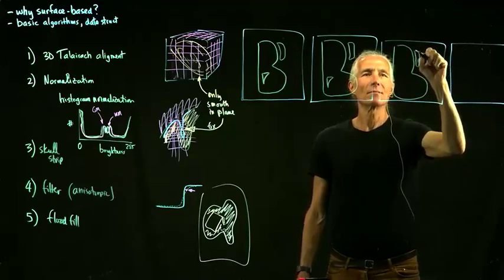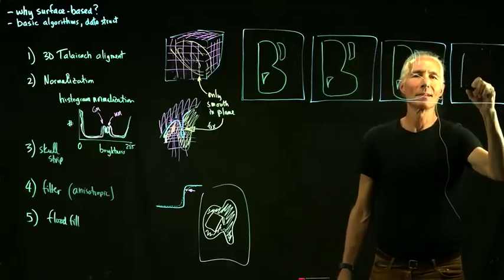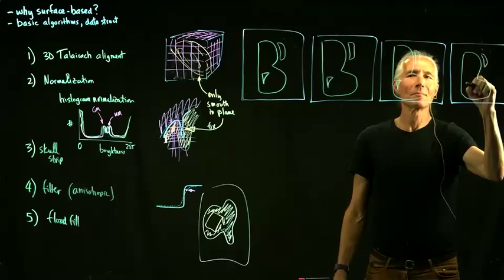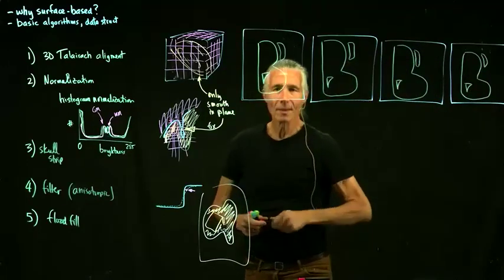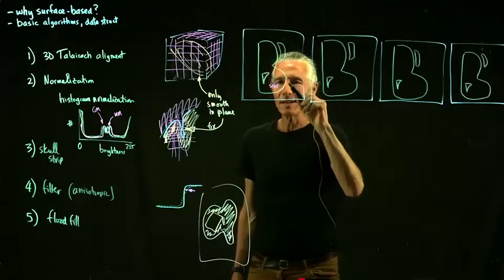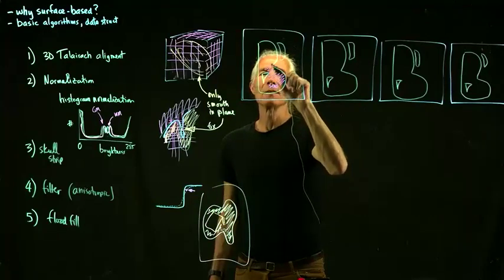Maybe your skull strip didn't work exactly correctly, and you've got a little bit of the skull sticking out. That happens all the time. So what we can do is start off by putting a seed in the middle, and then in 3D fill up anything that looks similar.